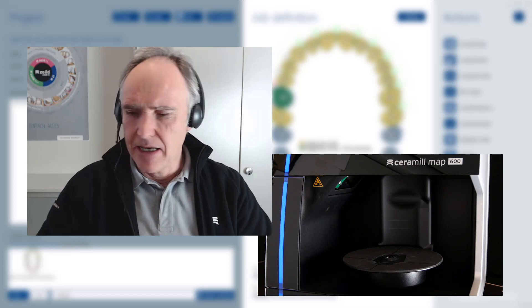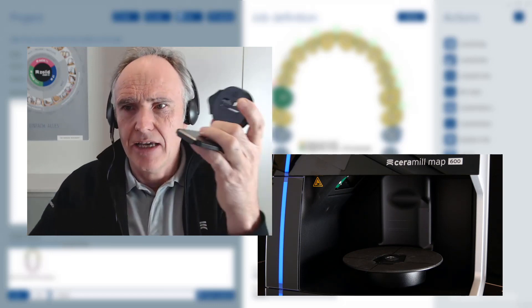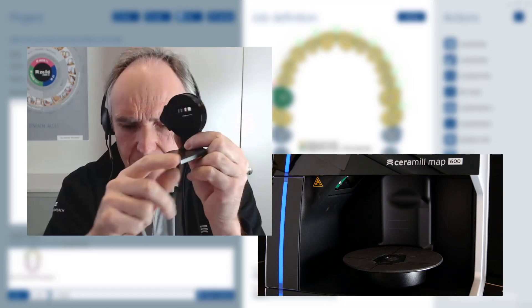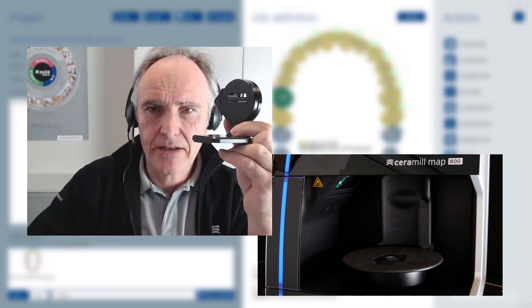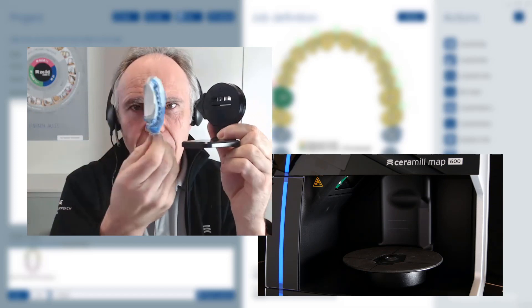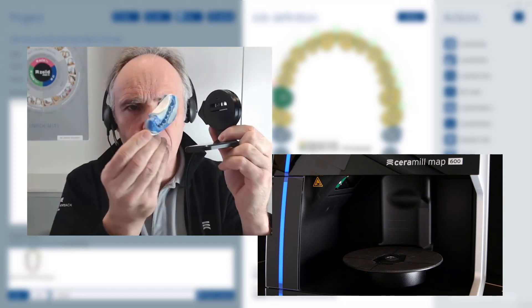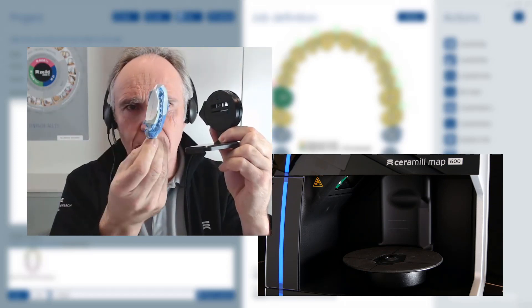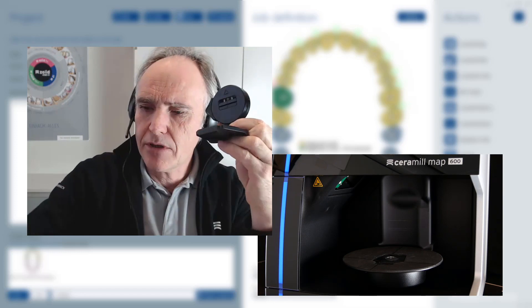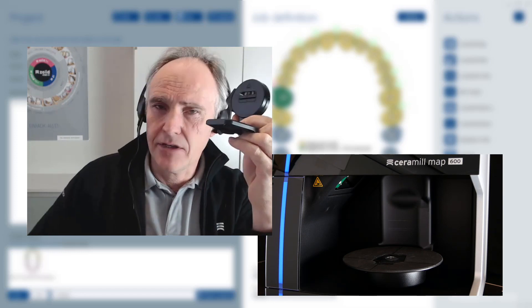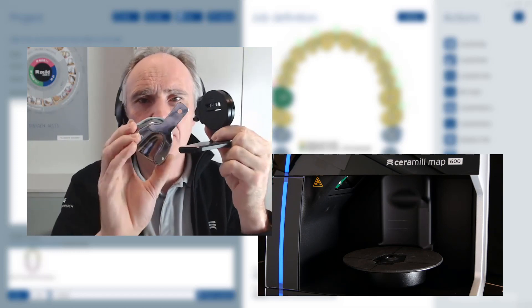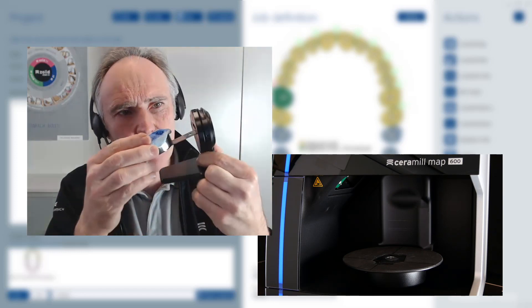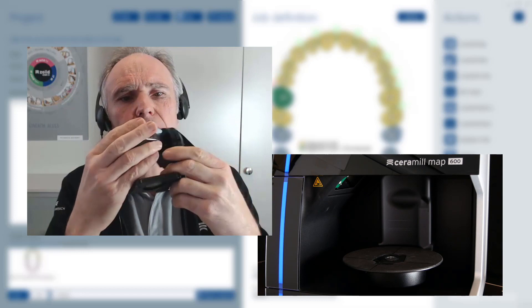The first feature we are talking about is this so-called impression holder. At the moment we have scanned this kind of special impressions, this triple tray impressions upper and lower together, and now we want to concentrate on the new feature, which is called a single arch, a single impression.